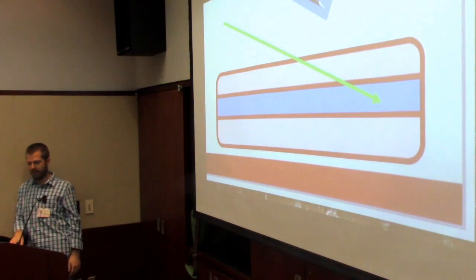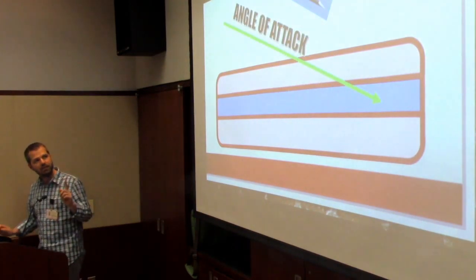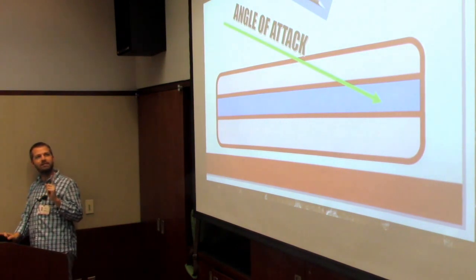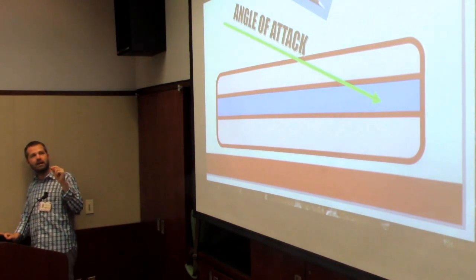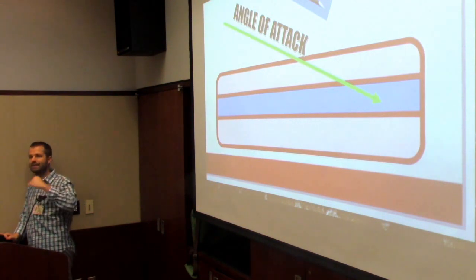So one is the angle of attack. Big dramatic angle of attack. The top picture is the bevel. For the longest time, people always say bevel up, and I had to Google what that meant as a medical student. And it wasn't until I watched a slow motion animation of someone placing a central line that I realized you're actually cutting. You're making a linear cut with the bottom part of that bevel into any tube.